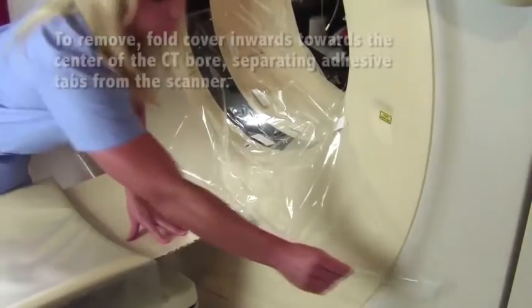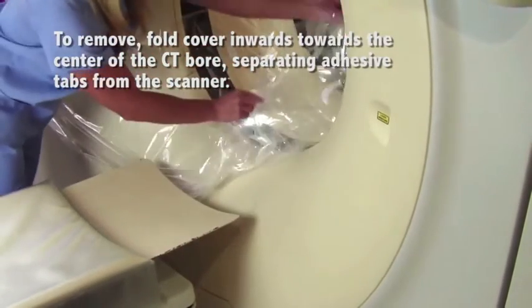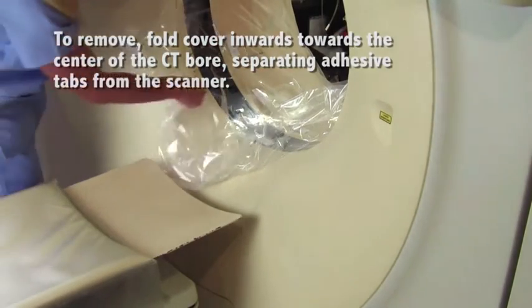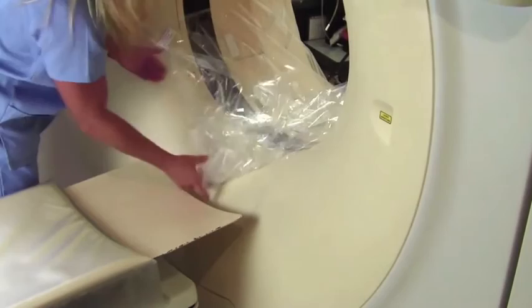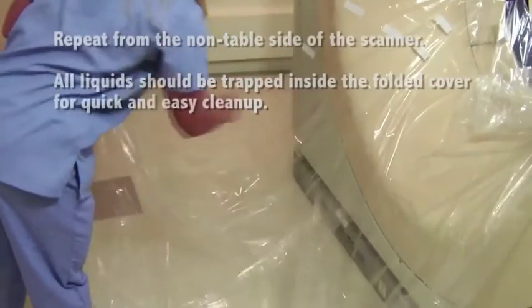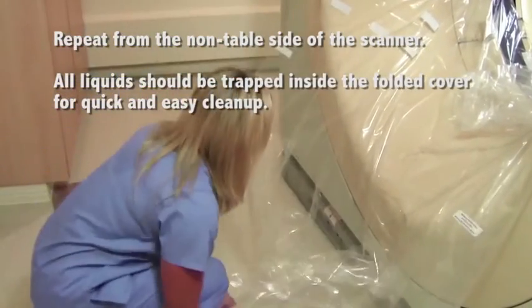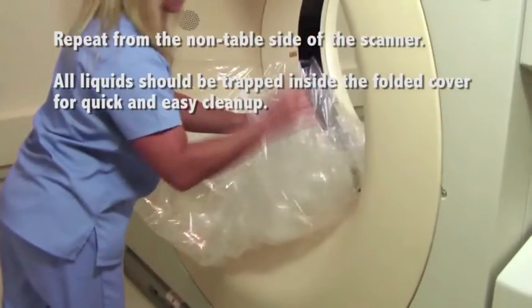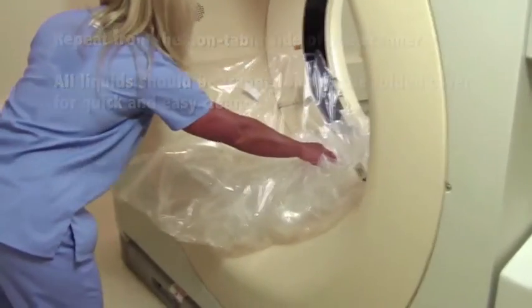To remove, fold the cover inwards towards the center of the CT bore, separating adhesive tabs from the table side of the scanner. Repeat from the non-table side of the scanner. All liquids should be trapped inside the folded cover for quick and easy cleanup.